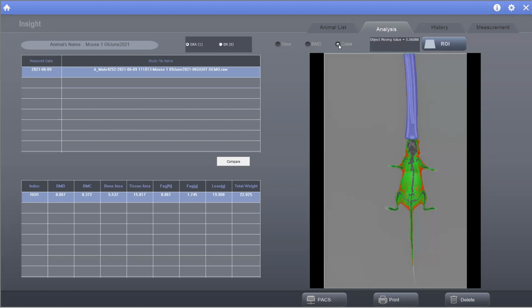So this was quite a small female or male? I'm just asking the team. They're going to let me know. Female? Great. So quite a small female.